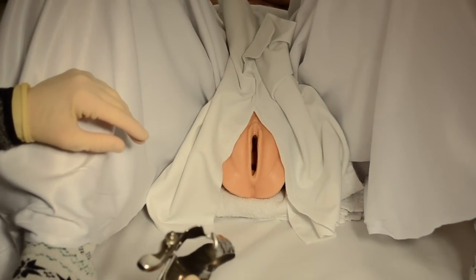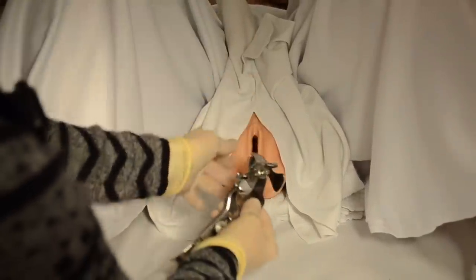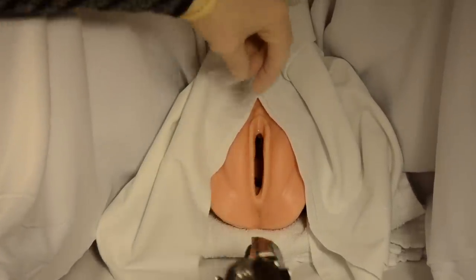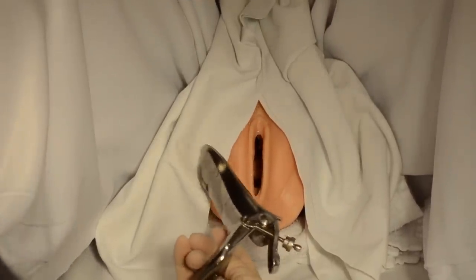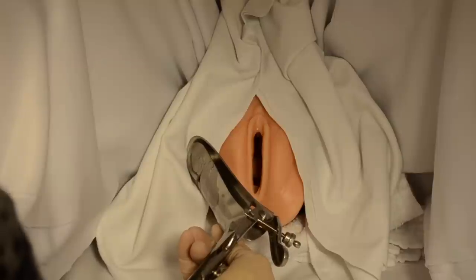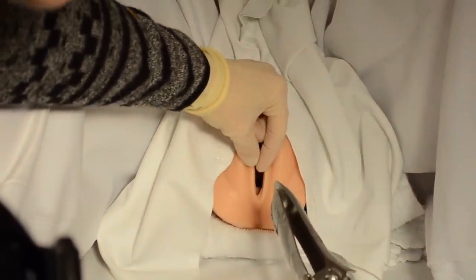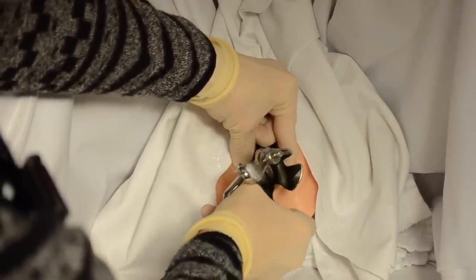I only uncover what I need to see, not someone's whole body — I think that is more respectful for the patient. When I put a speculum in, because I've got a drape here, I'm going to put it in on an angle whichever is more convenient. You will feel me touch your skin right now — I'm touching your knee and I'm going to put the speculum against you. You need to tell me if it's too warm or too cool. Now I'm going to touch your labia, the skin, and move the skin off to the side so I can put the speculum in place.